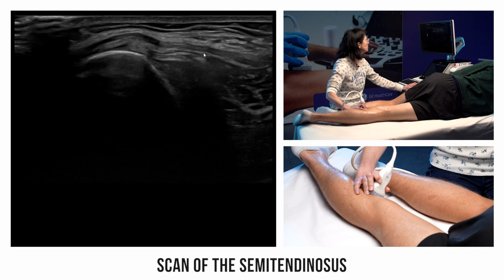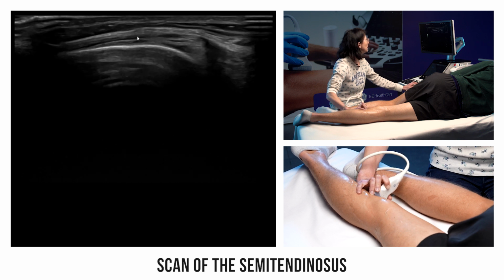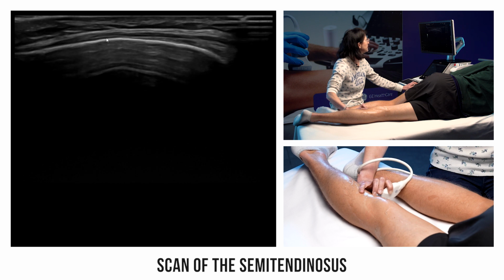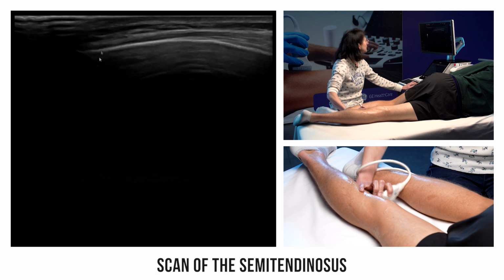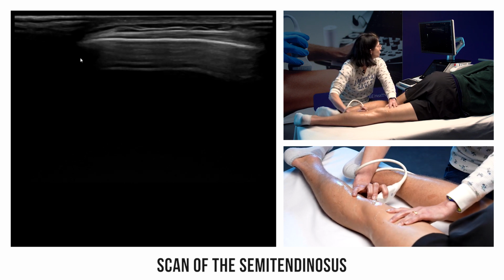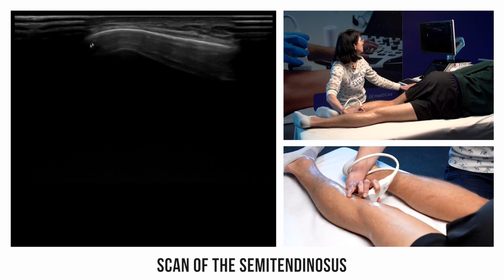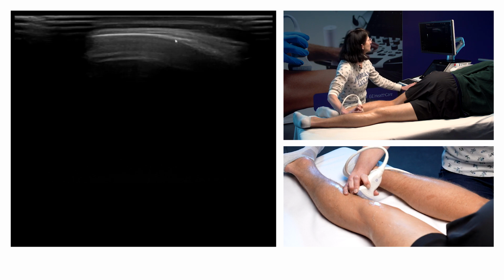If we continue forward, here is the end of the semitendinosus tendon, which inserts on the anterior medial cortex of the tibia and is fairly close to the anterior tibial tuberosity, which is hidden here. Turn your knee slightly to back. And now we are virtually on the tibial tuberosity. We can do the same thing with the other tendons.